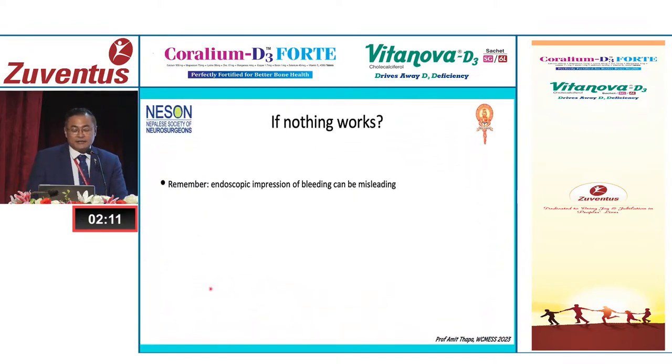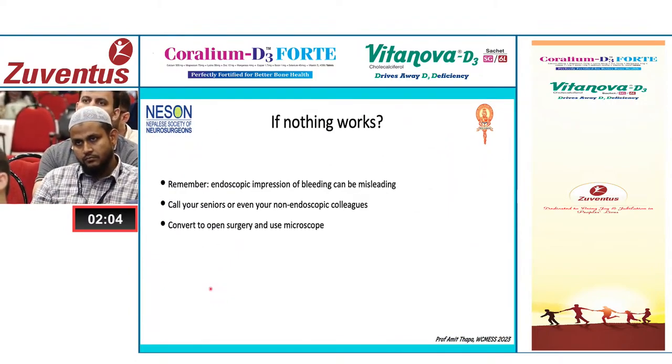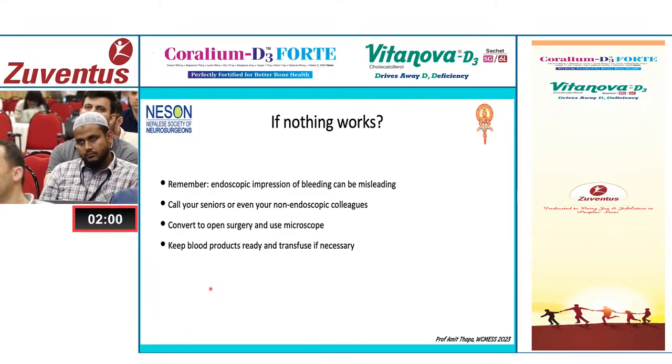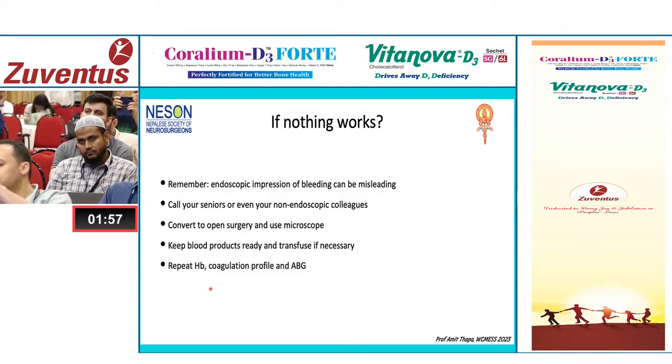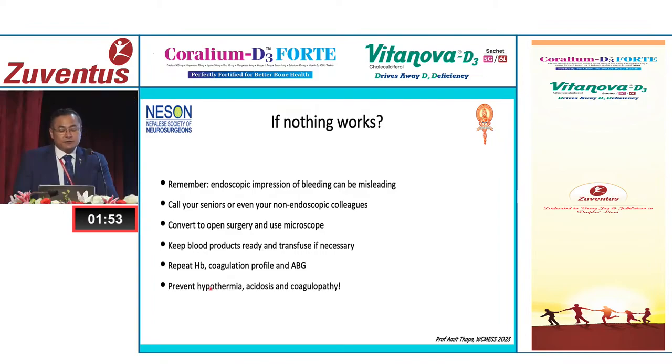And if nothing works, then of course, you can call your seniors, and your non-endoscopic colleagues can also be of help. You can convert to open surgery, use a microscope, keep your blood products ready and transfuse if necessary. We have to repeat hemoglobin, coagulation profile, and ABGs. And remember, these are patients where hypothermia, acidosis, and coagulopathy need to be prevented at all times.